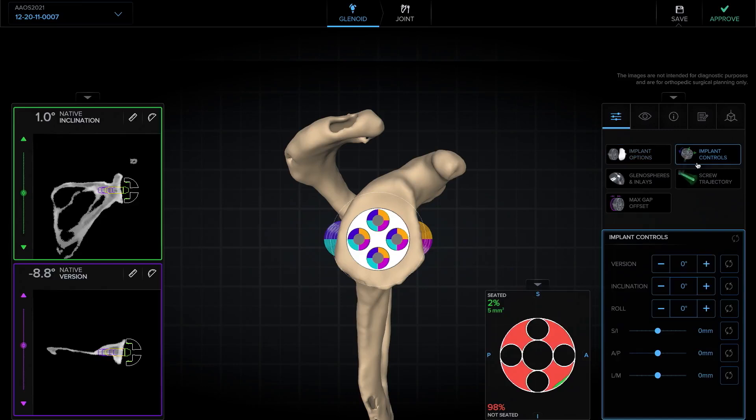Now we'll move on to implant controls. I like to start first looking at the axial. Typically, I'll leave the patients in a little bit of retroversion for several reasons. The first is because it does not affect clinical outcomes. The second is because a little bit of retroversion — between seven and eight degrees — will allow the post or the screw to be completely contained in the vault.